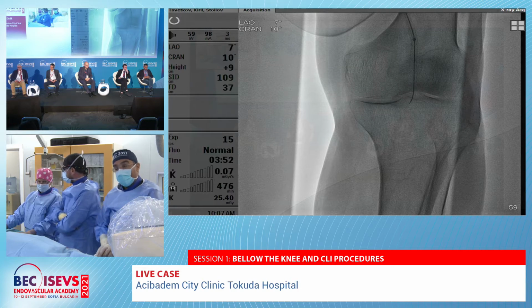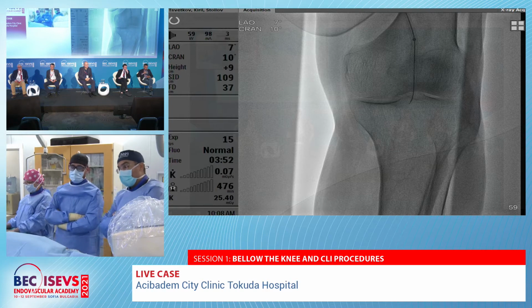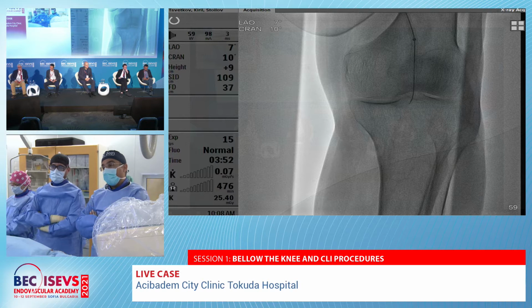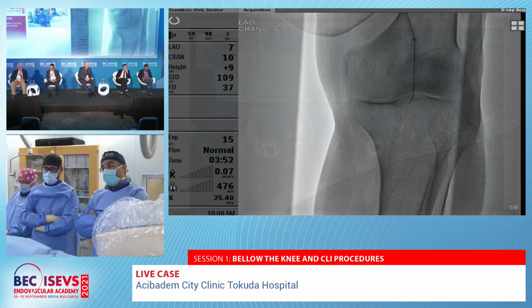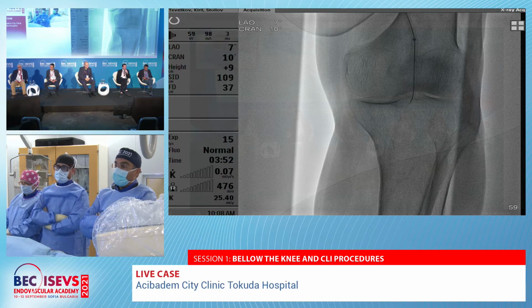So hi everybody, thank you for the kind invitation and thank you also for the hospitality here in this cath lab. This case is a challenging case because we have the endarterectomy of the popliteal artery. So we have the stent has no stenosis, we will see now the angio. And the point is we don't know what happens with the reconstruction of the artery. If we have thrombus inside them, the outflow is really very poor.